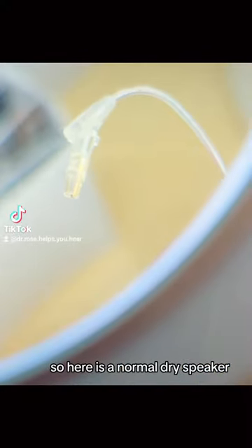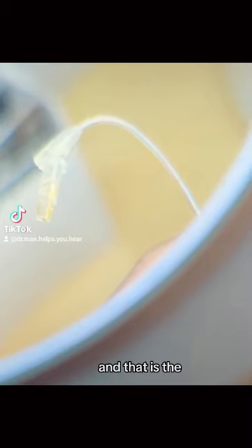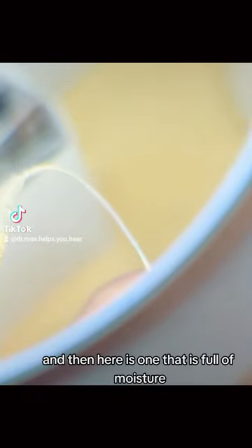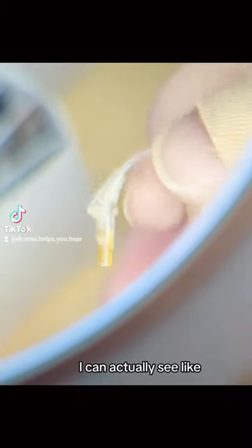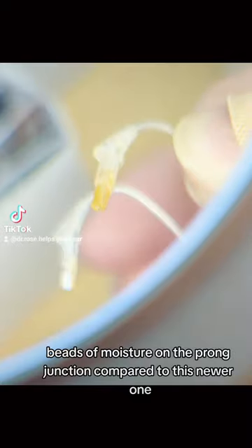So here is a normal dry speaker or receiver wire, and that is the gold hook that goes into the hearing aid. And then here is one that is full of moisture. You can tell it's very orange, and through my magnifier, I can actually see beads of moisture on the prong junction compared to this newer one.